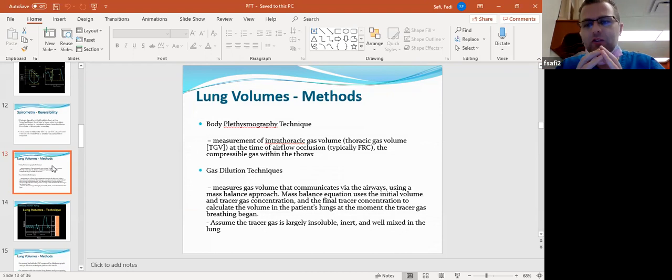In that way, they measure your lung volumes and lung pressure. The first measurement is the functional residual capacity, which is the amount of air that remains in the lung after a normal tidal volume. I will show you what the functional residual capacity looks like.